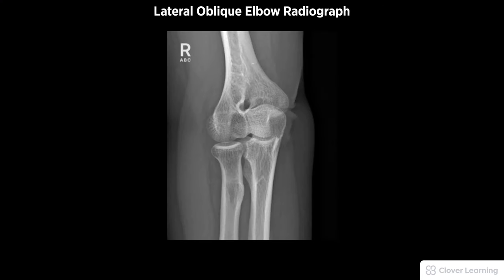A diagnostic lateral oblique elbow radiograph must be free of motion and have a 45-degree lateral rotation. Demonstrated anatomy to include the radial head and neck will be projected free of the ulna, with proper visualization of soft tissue and bony detail.